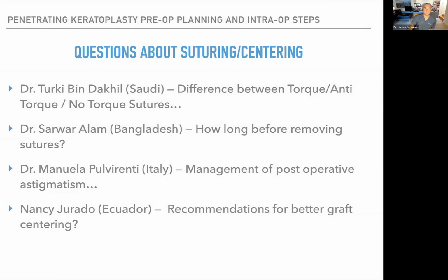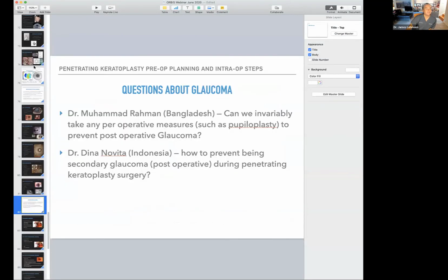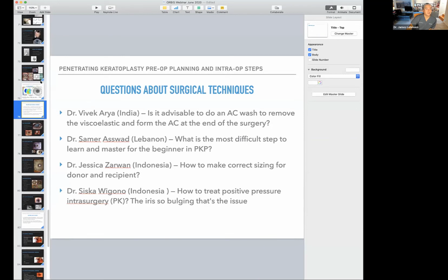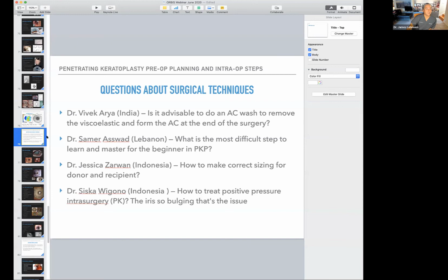So some questions about suture centering. These were sent before. Let me get back to that slide. Dr. R asked beforehand, is it advisable to do an AC wash to remove the viscoelastic and form the AC at the end of surgery? Yes, like you saw, before I do the running suture, I get the viscoelastic out of the eye.